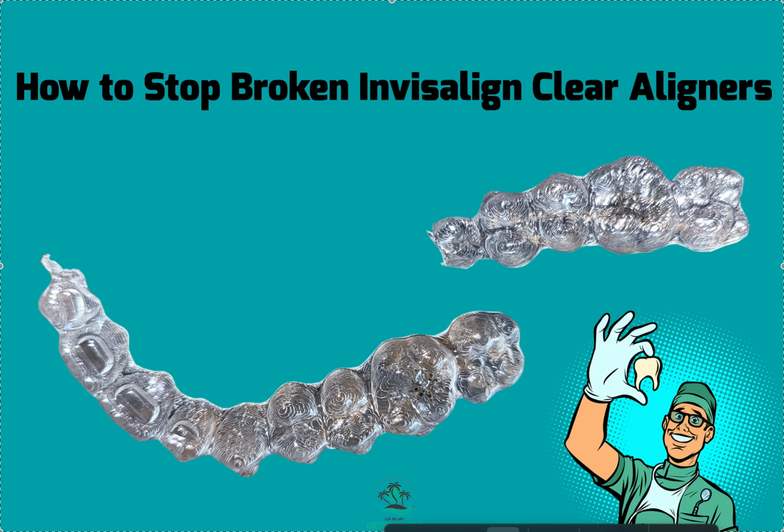I tend to see more breakage with Invisalign clear aligners than I do other brands of clear aligners, not because they're bad or inferior, but because they have a lot of features that could weaken them theoretically, like, for example, eruptive guidance pontics, which is right here where this one broke. A lot of other aligner companies don't have EG pontics, nor can they take such difficult cases with such twists and turns and ins and outs.